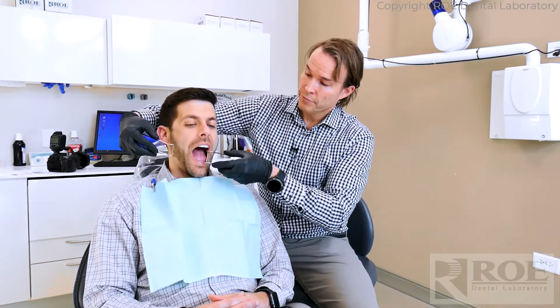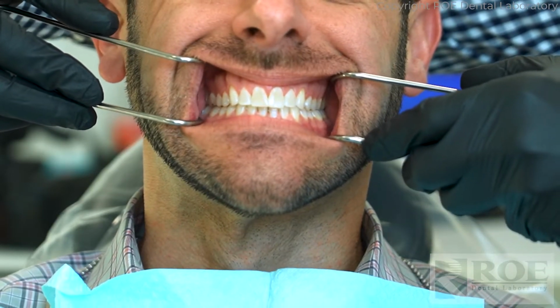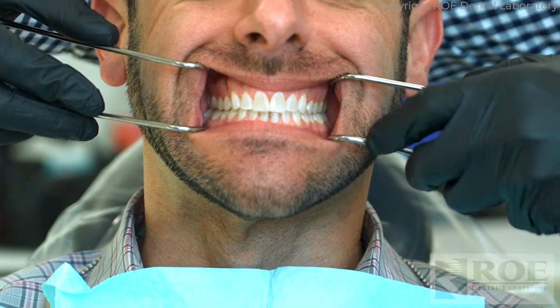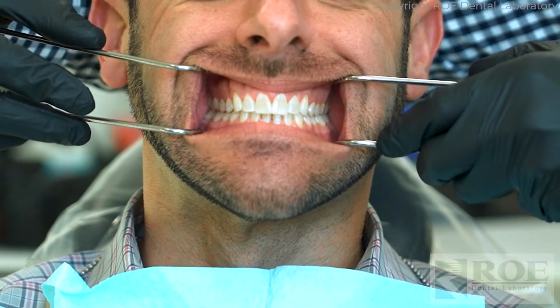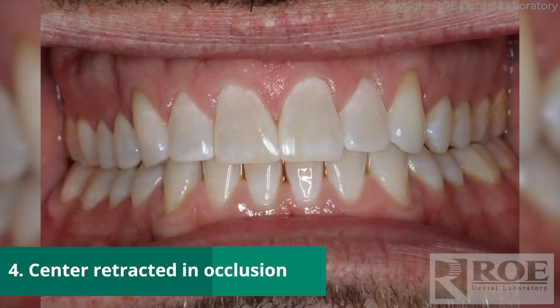So retracted photographs, these are retractors, and really the goal is just to move the lips and the cheeks out of the way so that we can capture these photographs. All right, so you have the patient, and you could have the patient practice before to make sure they bite into a habitual bite, but you'll just simply hold the cheeks back, and then you'll see the 3 photographs that are needed for Chrome. There are a couple of pitfalls with intraoral pictures.